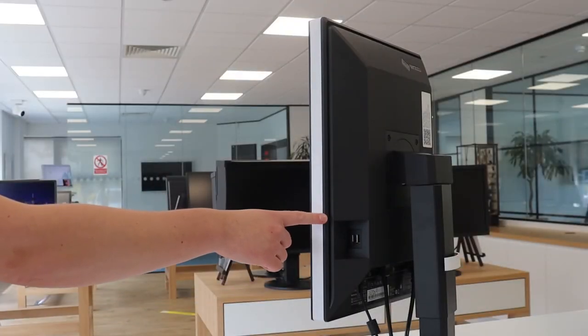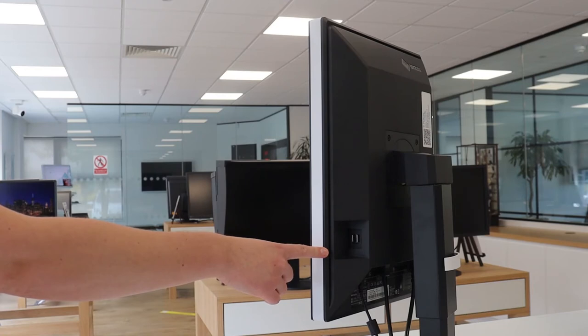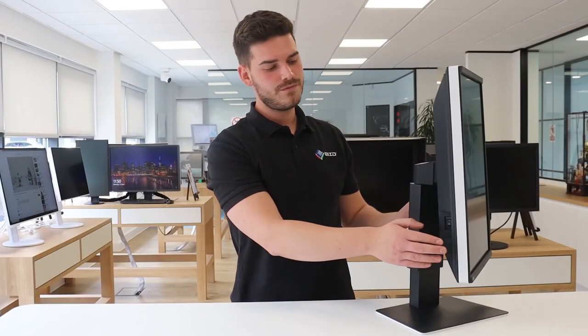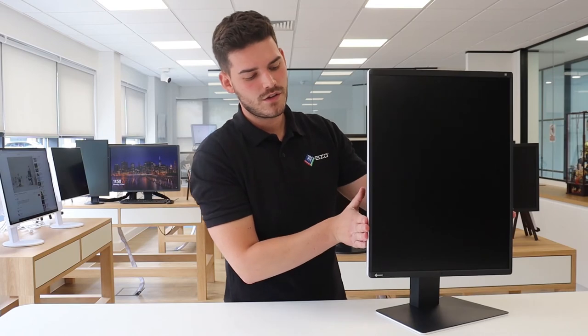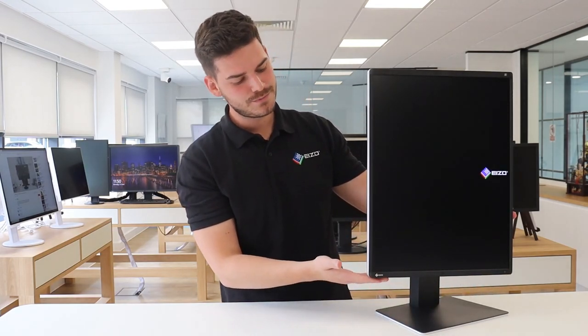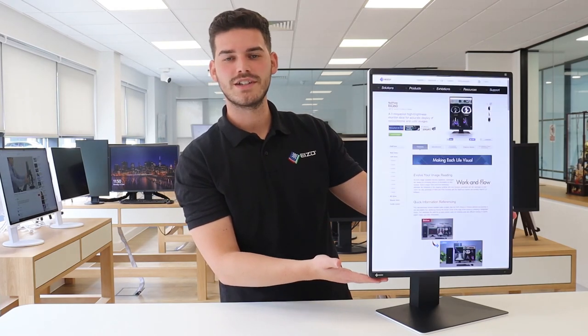The monitor comes with two USB downstream ports on the side. This can be treated as a USB hub and, for example, used to connect a keyboard and mouse. The cable holder on the rear of the monitor can be used to keep cables tidy. Ensure the rocker switch is in the on position, then go ahead and turn the monitor on using the front power button to finally see your image.